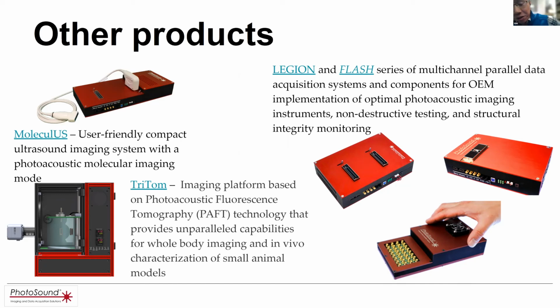Yes, that's a good question. Actually, for a 4 microsecond pulse duration, it typically will generate an acoustic wave with a central frequency of about 350 kilohertz, which means that it's lower than almost all the commercial linear array devices. Here we are using the P41. The central frequency is, I think, around 2 or 2.5, because it's from 1 megahertz to 4 megahertz. But actually, it also covers down to 100 kilohertz.